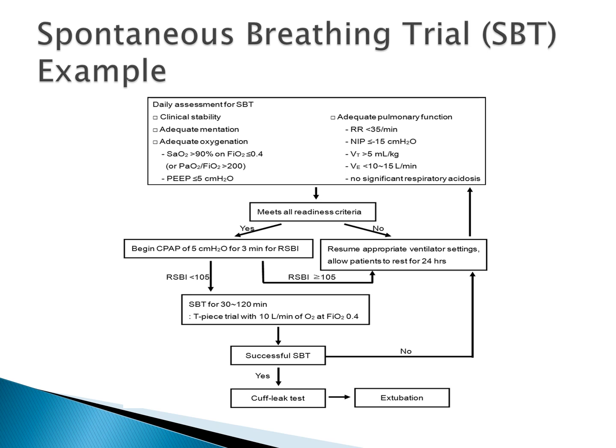There can be some false negatives. I say that like you've deflated the cuff, but you still don't get a leak. Sometimes you can get some gelatinous secretions that form around even a deflated cuff and don't permit a leak. So just be aware of the potential limitations. And then hopefully if all of the criteria are met, then they can be extubated.